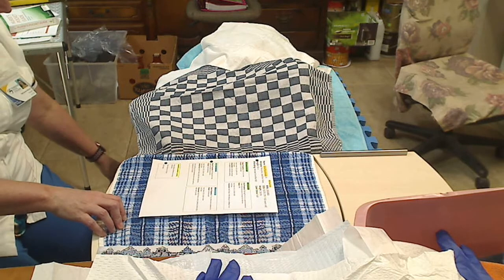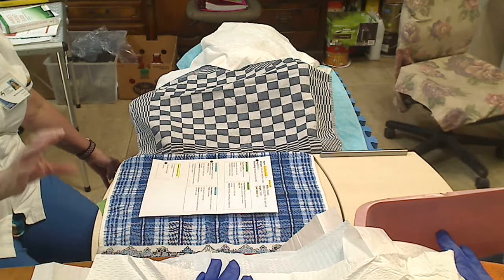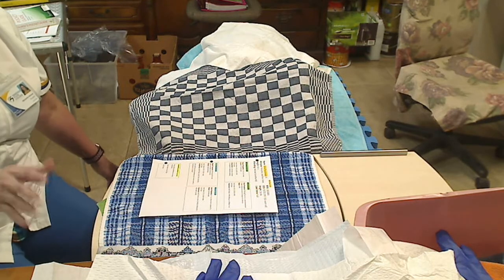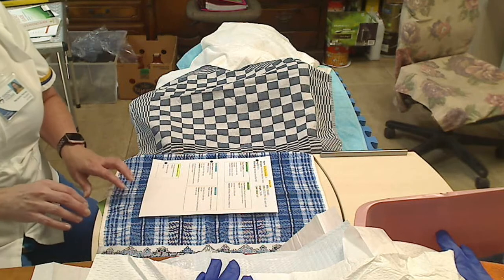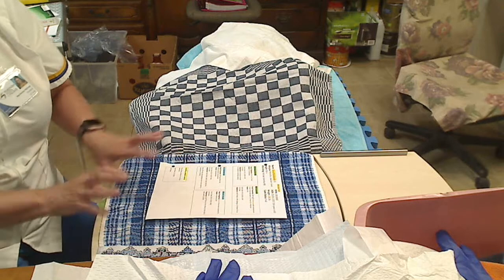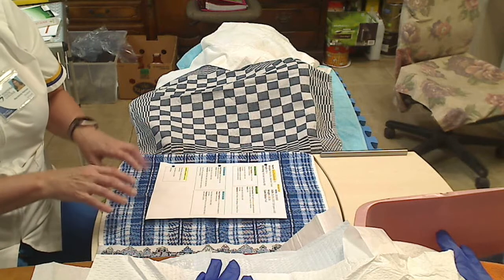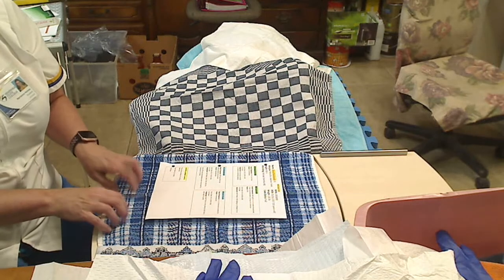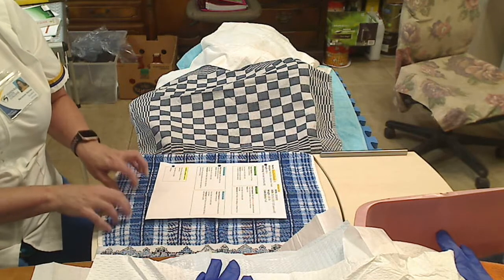that currently, even though I don't have a measurement, the approximate value that I'm seeing within the bag is approximately 150 milliliters, which is a good amount of urine. So that was really holding on to her. I'm going to document that I see approximately 150 milliliters of urine. The color is yellow. The clarity is nice and clear.